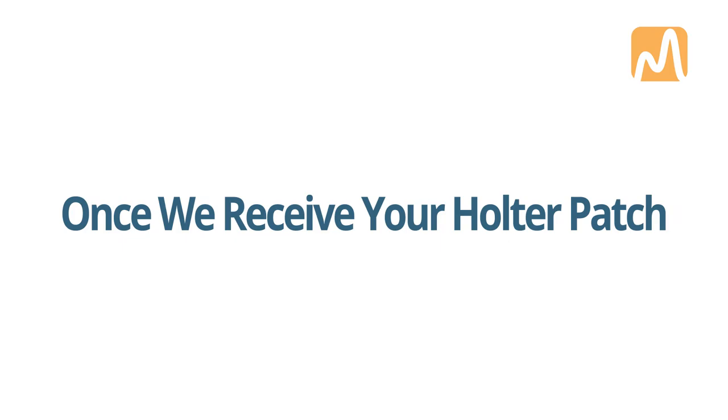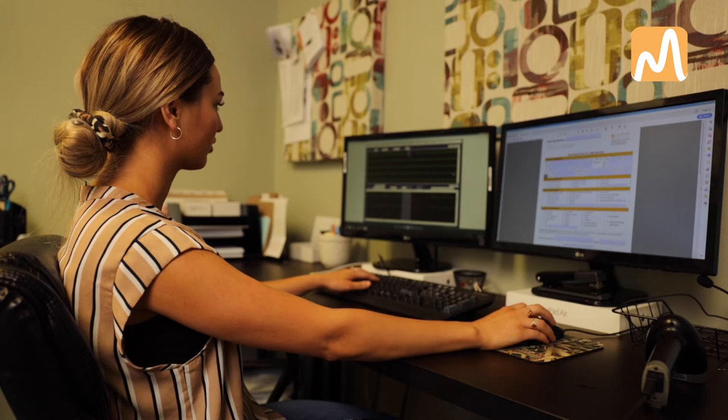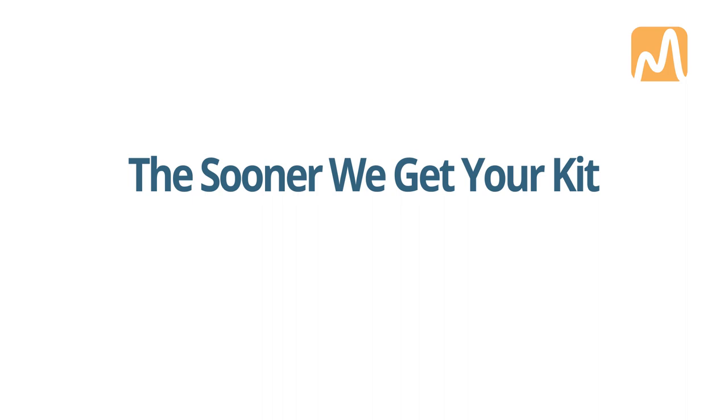Results. Once we receive your Holter patch back at our center, the cardiac technologists at M Health Solutions will prepare a report and make it available to your doctor. Remember, the sooner you get your kit back to us, the sooner you will get your results.